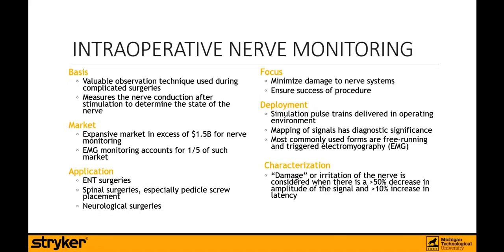The market for IOM is quite expansive. It's in excess of $1.5 billion, and electromyography specifically, which is a subset of IOM, accounts for a fifth of this market. The focus of IOM is to minimize damage to nerve systems and to ensure the success of the procedure. The characterization of the IOM signal helps us determine if there's damage or irritation to the nerve.